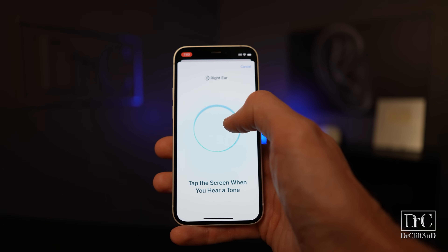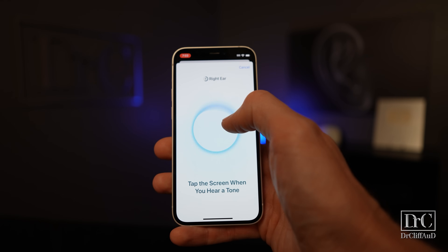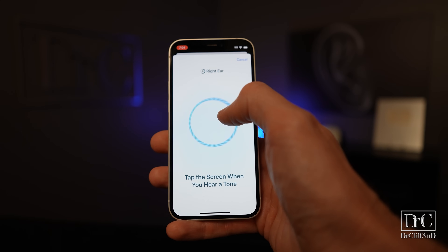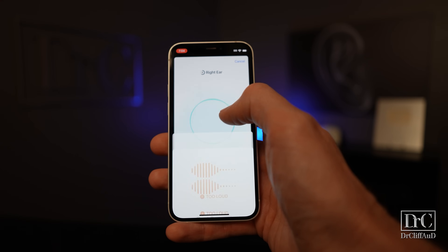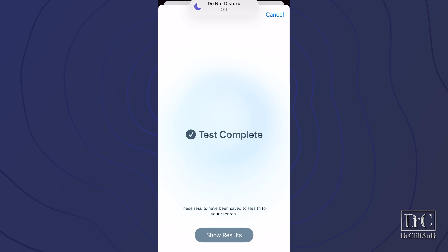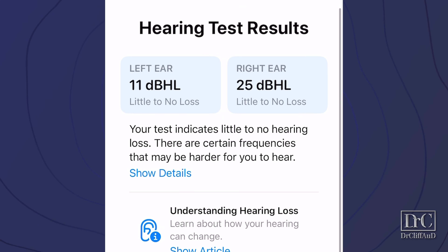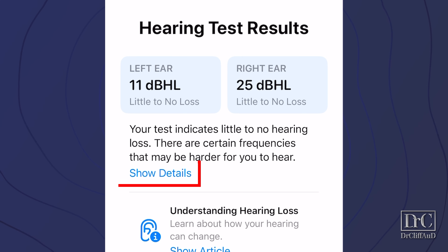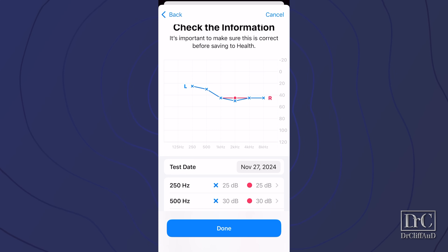During the test, you will hear different tones at different loudness levels. When you hear them, just simply tap on the screen of your phone. The test takes around five to eight minutes and will pause if your background noise levels get too high. Once you complete the test, you will see your average results displayed in dB HL — the higher the number, the more hearing loss you have in that particular ear. You can also click on show details to see your hearing loss plotted on an audiogram, like you would see if you went to an audiologist.